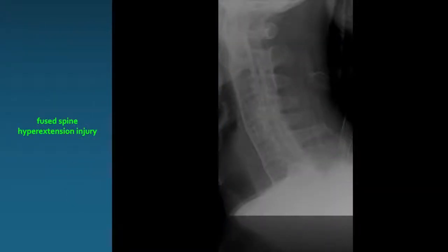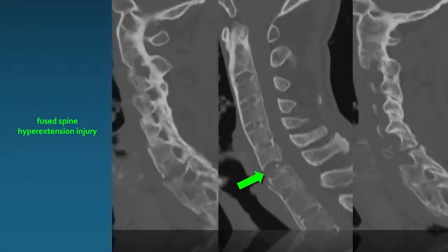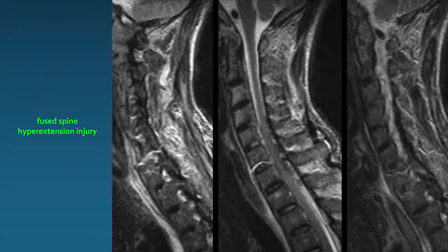Here's a radiograph from a patient that had come over to CT, and that's the radiograph initially. Here's the CT image, and so I think that this neck had snapped in between getting the radiograph in the trauma bay and getting the CT. And on the parasagittal views, we see the fracture propagate across in a transverse plane. Again, high index of suspicion is critical for these patients. Here's one with the MRI where you can see the fracture line acutely with high signal tracking through it and around it in this patient.